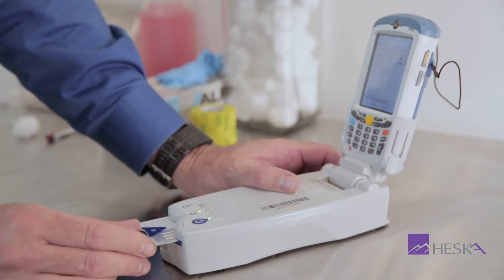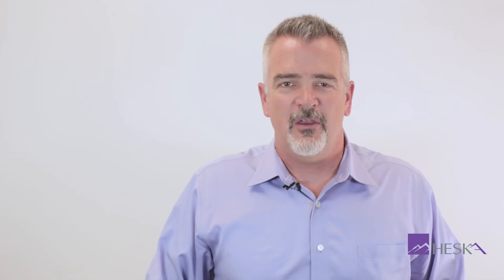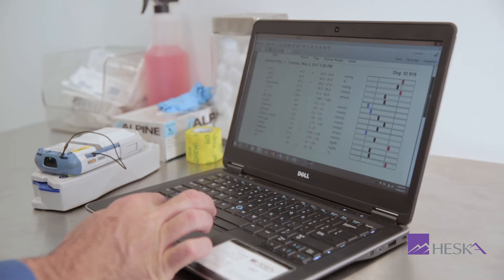Using the EPOC is extremely simple. With test cards that are stored at room temperature, there's no warm-up time necessary, making the difference when the need for a treatment plan is immediate. Insert the test card, introduce the sample, then view results on a convenient color touch screen. With Bluetooth or Wi-Fi, connect to your practice management software or print directly to the EPOC's optional wireless printer.